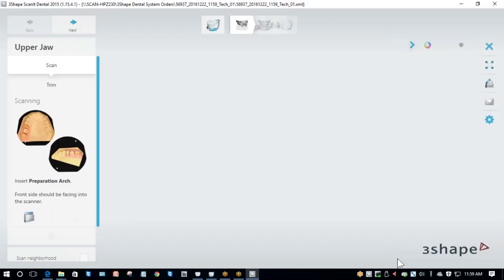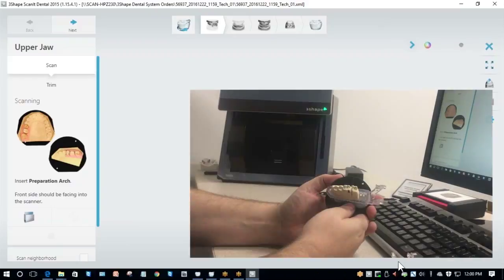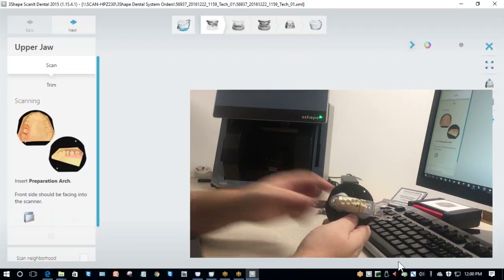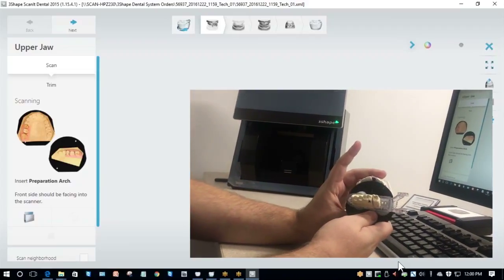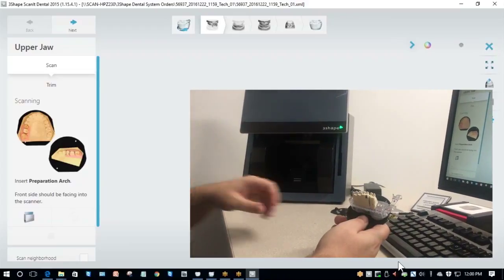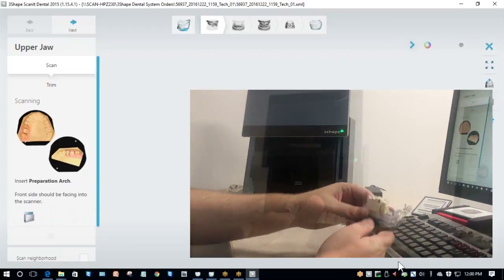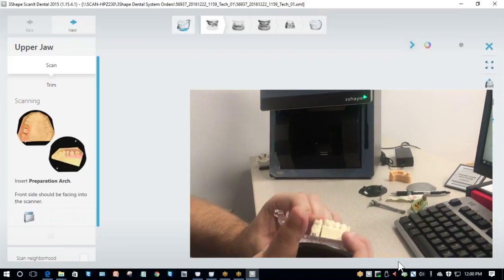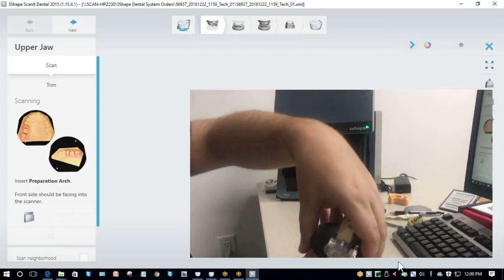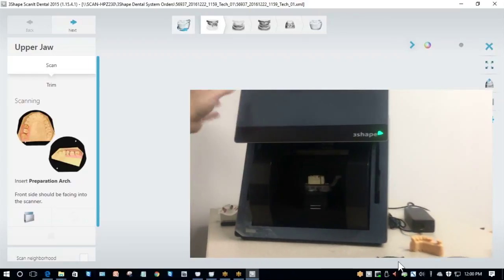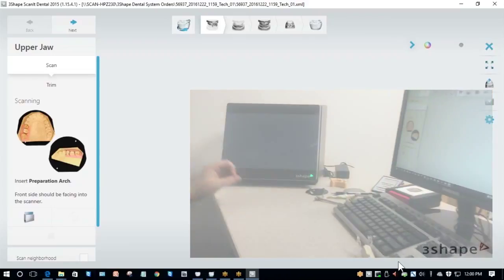Now that I've done all that, I'm going to click Scan. Now that my scan software is loaded, I'm going to put my model in the scanner. It's really important to keep track of how you're placing the model on the plate. You'll notice on the plate you've got a flat side and a round side. You want to make sure that the buccal side of your model is on the round side. If you have a full arch case, make sure the anterior teeth are on the round side. The case I'm scanning is a quadrant, so I'm putting the buccal side on the round side, loading it into the scanner, closing the door, and hitting Next.